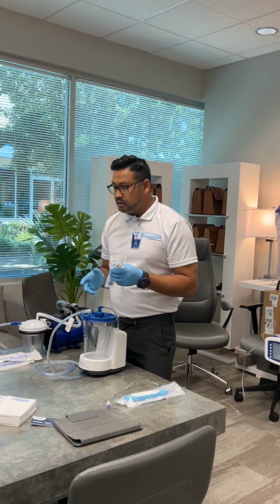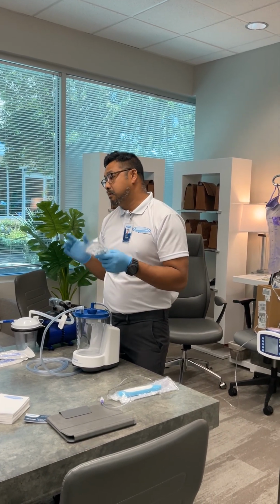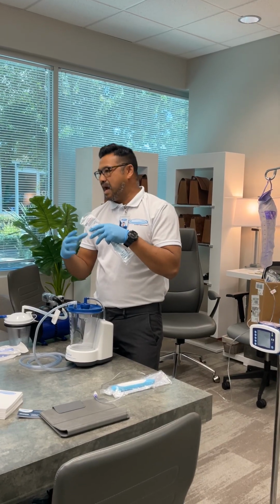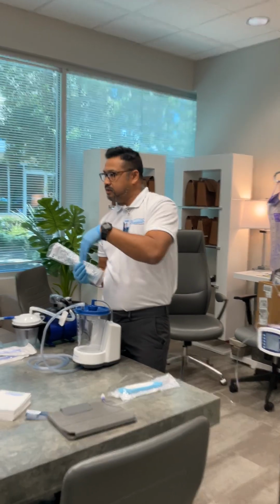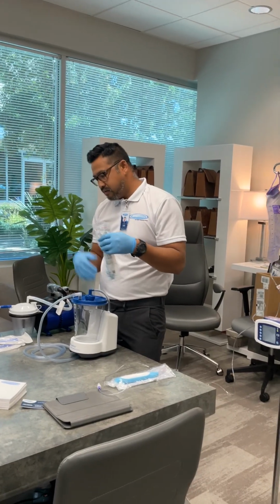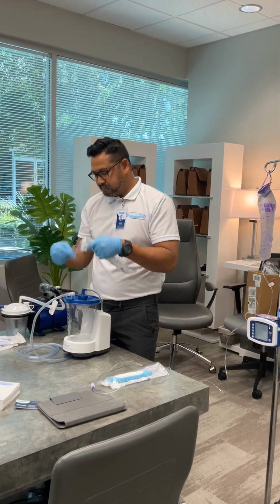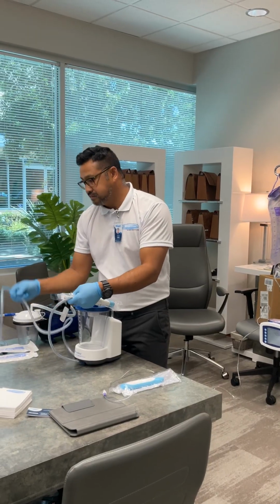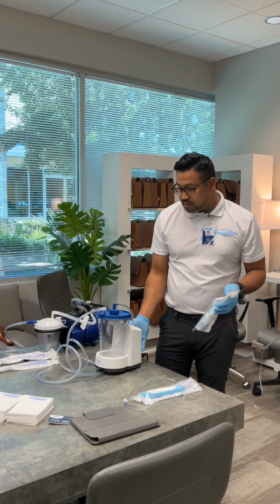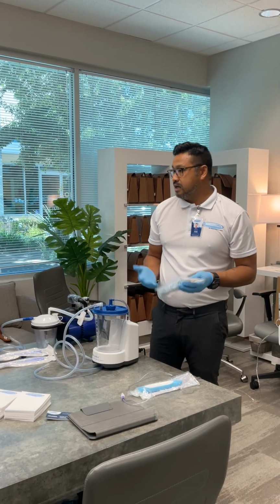The male version, I'm not sure if it's on the portal just yet, but there is a kind of pouch, so to speak, and it goes in there. It tapes on the pelvic bone or pubic bone, and then it drains into this. Same thing. So pretty much you turn it on, set it, forget it, and that's all it does.